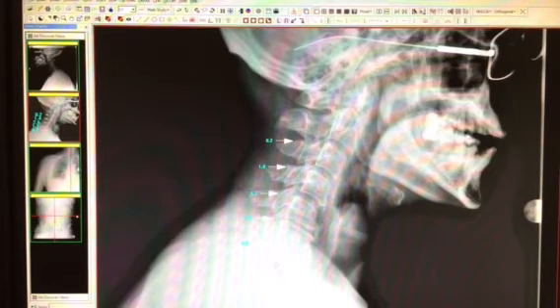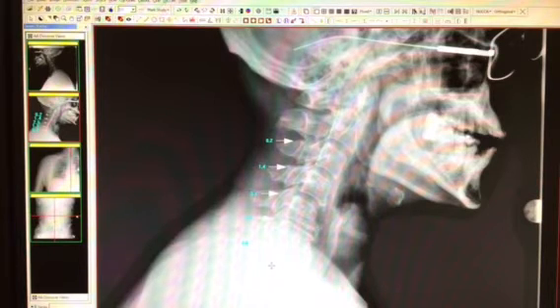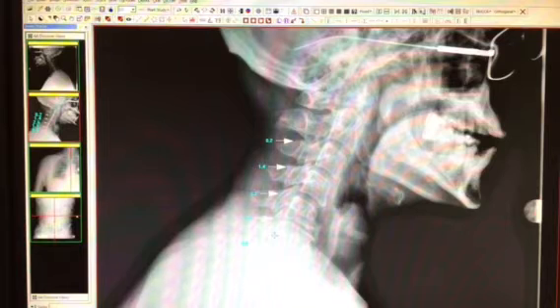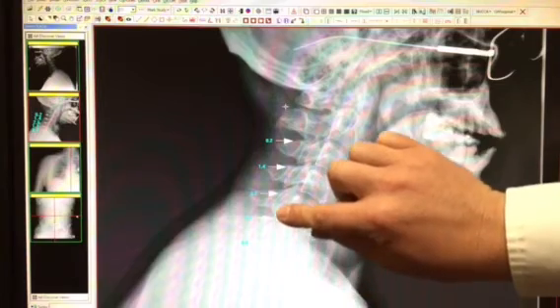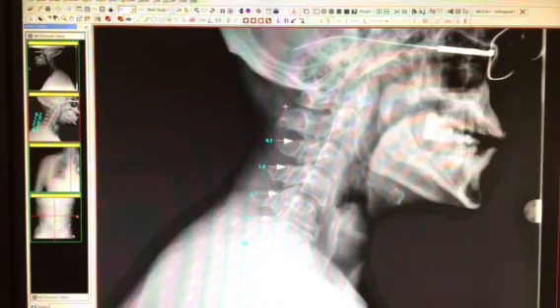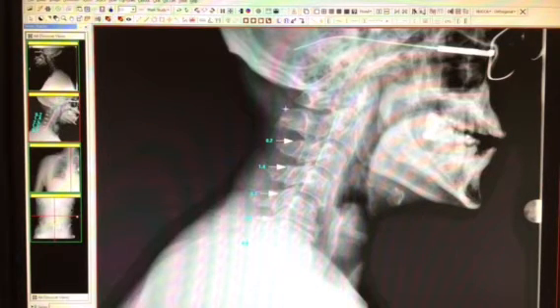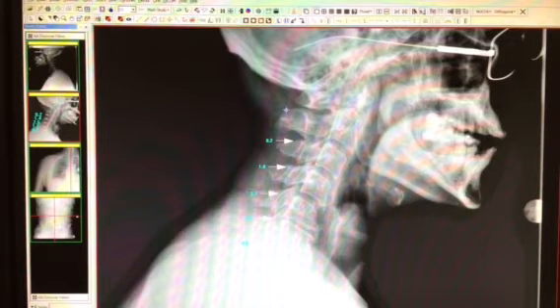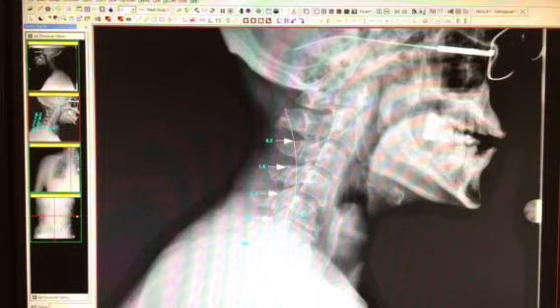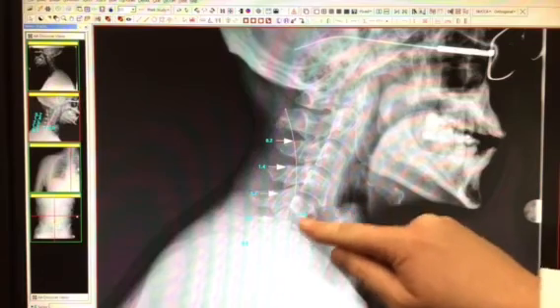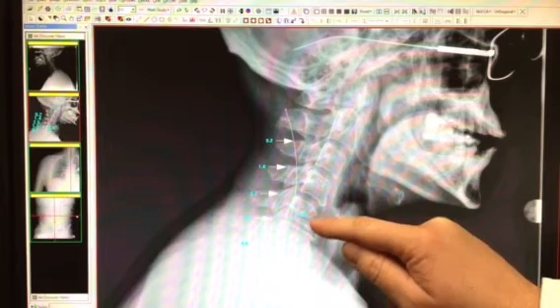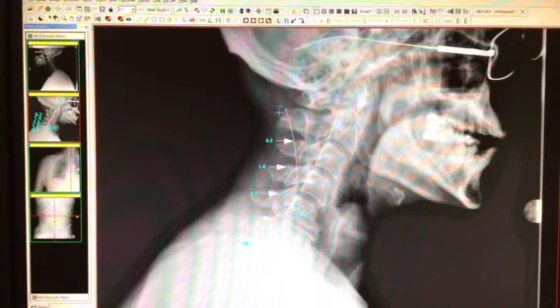The computer will take each of these measurements and ratios to help calculate the cervical lordotic curvature. To do that, you need three points. The bottom point is always the posterior inferior aspect of C7. The next point is directly above the base of the cervical spine, level with C2 — this is where the actual center of gravity should be. We then mark the very center of the C5 vertebral body, which creates the cervical lordotic curvature. We use C5 because it is the crux point for the cervical spine — where the load goes forward.